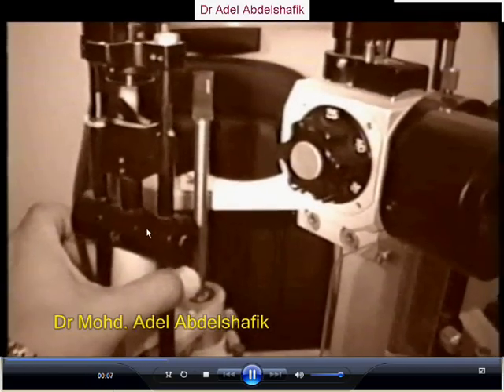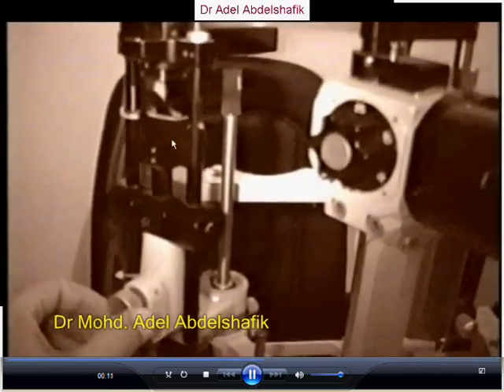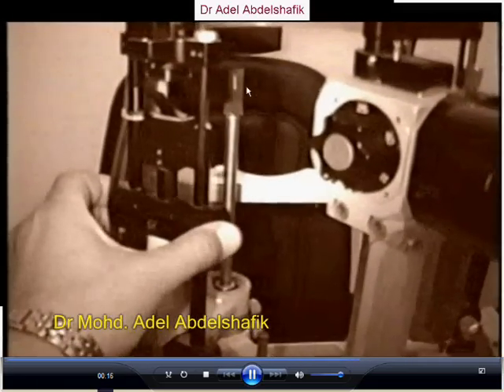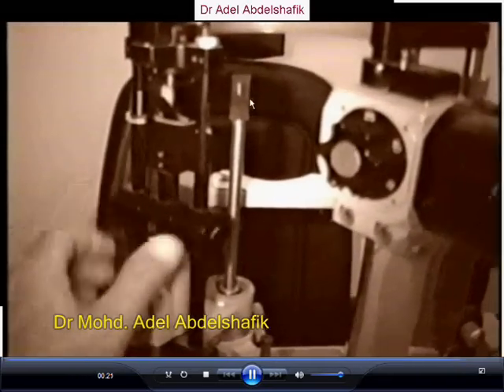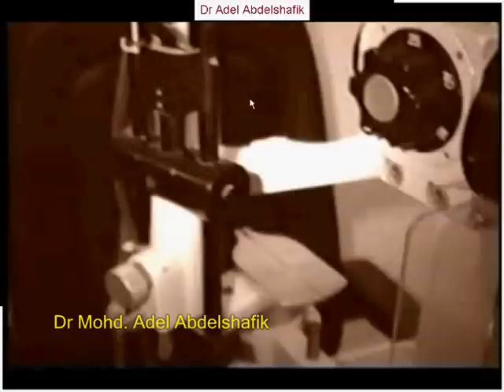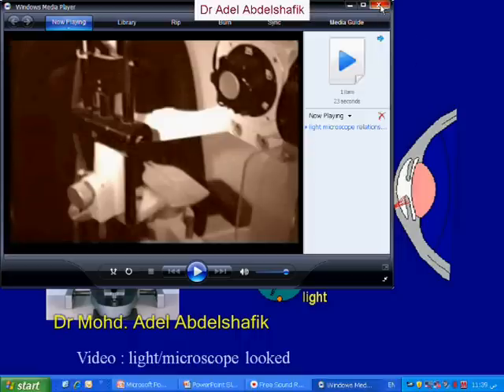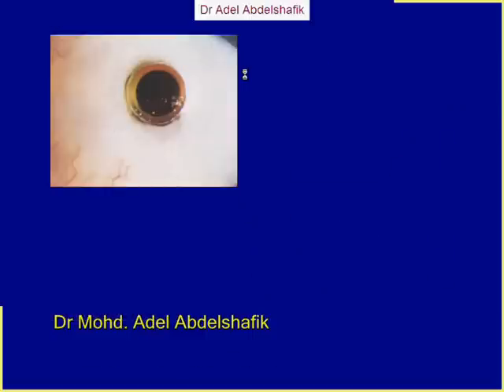You see here, I can move the whole band of the slit. This is the lock. This is locked now, so the light is fixed at this point. If you unlock it, you can change the location of the light. So in the indirect illumination, we need to do this trick. We need to unscrew this part to move the light to either side.